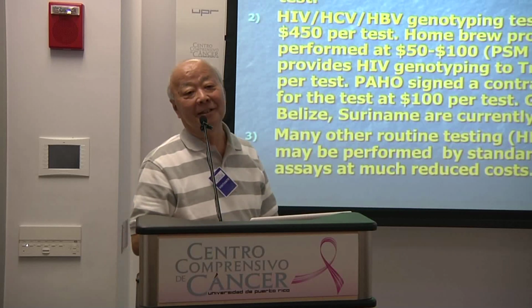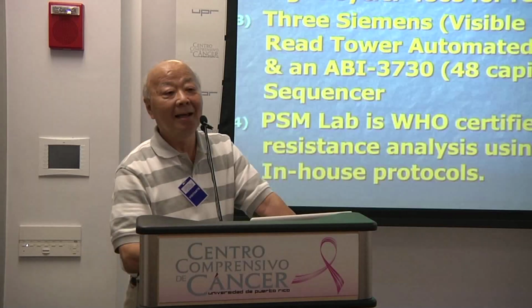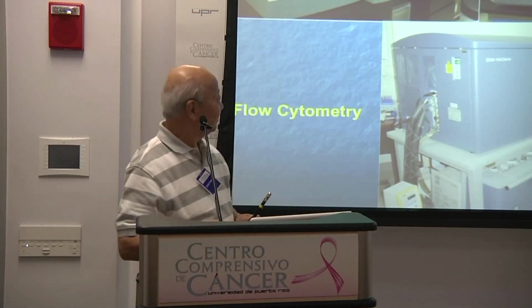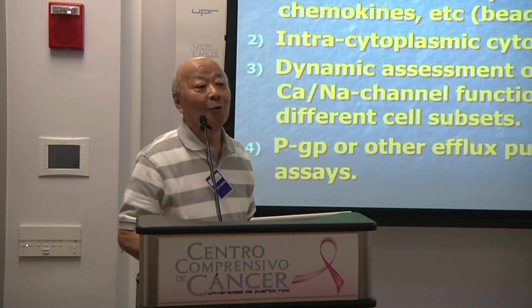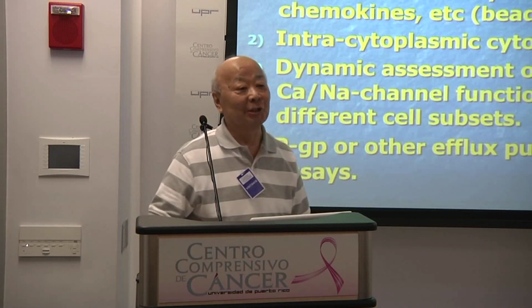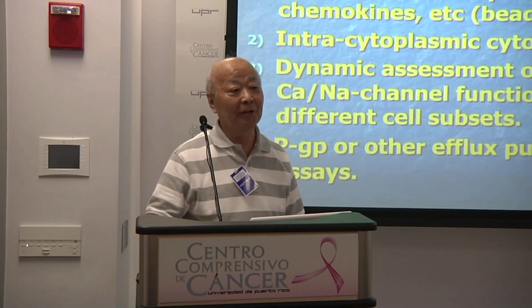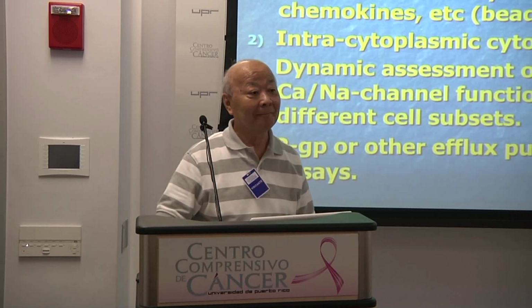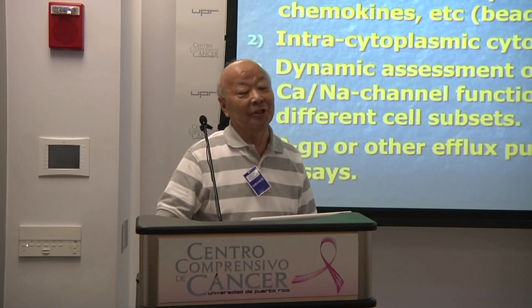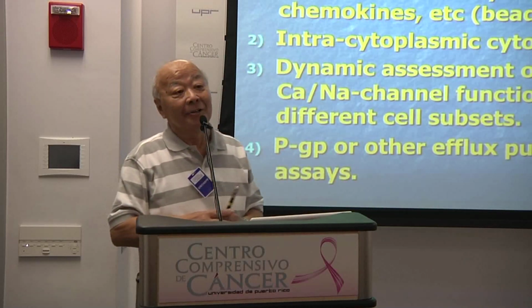We discussed with the CDC, PEPFAR person in the Caribbean. Dr. Yamamura, what do you mean by homebrew? Homebrew research protocol. So it's not kit-based. You buy each reagent and you standardize. So you have to perform that for viral loads? Yeah. And of course, there are many validation panels nowadays.